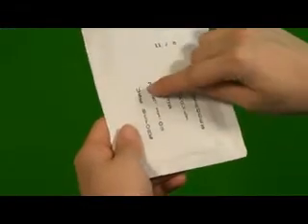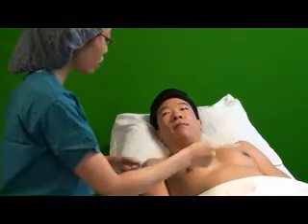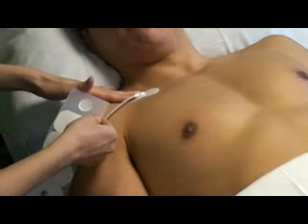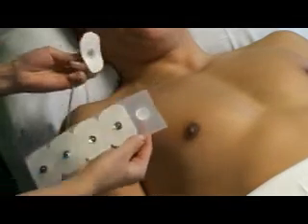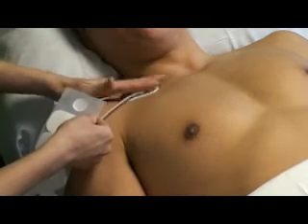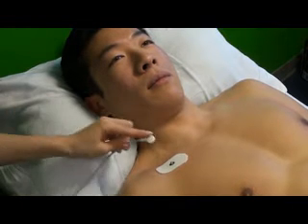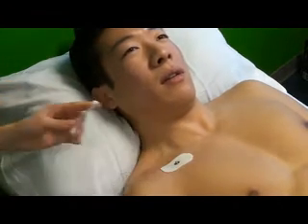Check the expiration date on the electrode packet. If the electrodes have not expired, open the packet and remove them. If the patient is conscious, explain that the electrodes may feel cold. Place the electrodes with gentle downward pressure. To minimize artifacts in the ECG, avoid bony prominences and major muscle groups when selecting sites for electrodes. If you are using snap-on lead wires, attach the lead wires to the electrodes before placing the electrodes on the patient's skin, as attaching them afterward may require undue force, causing patient discomfort and spreading the conducting gel, making it ineffective.